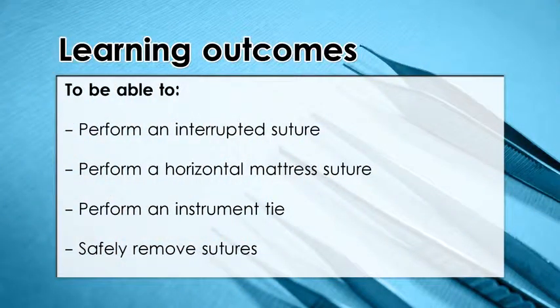So to summarise, today we've learnt how to perform an interrupted and the horizontal mattress suture. We've learnt how to form an instrument tie, and we've also learnt how to safely remove sutures.